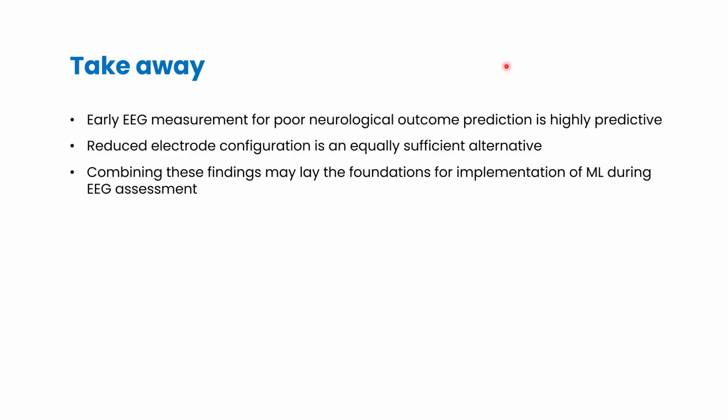I would actually just comment on that. I think that if you look at things like burst suppression, that is probably best picked up in the time domain. I can also see what Justin's talking about in more of the background activity. Frequency domain may be better for that kind of stuff, but cool, nice.